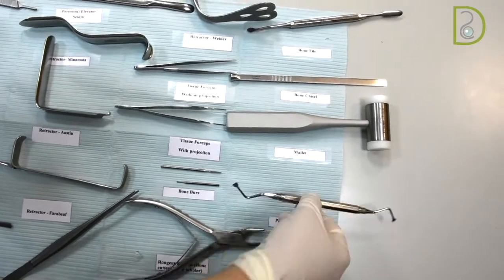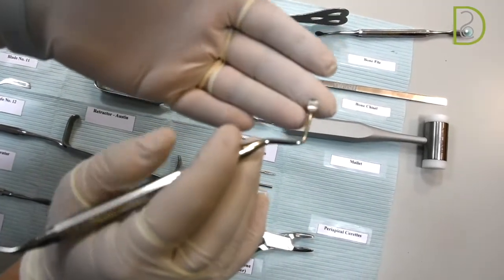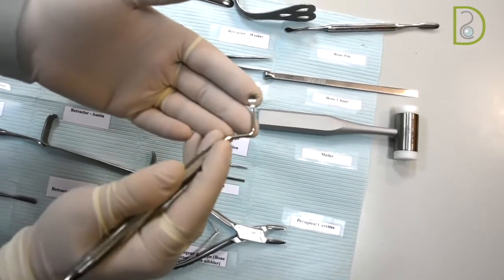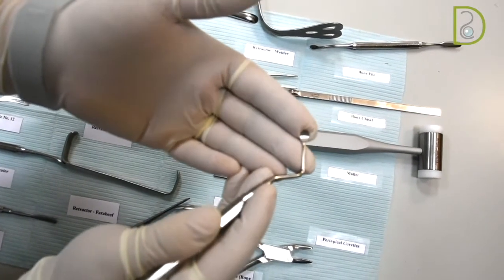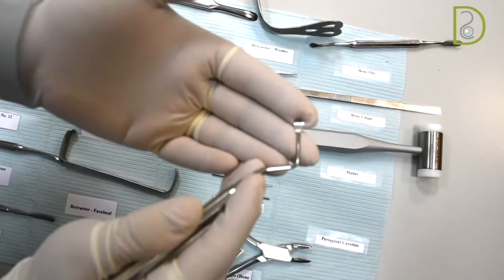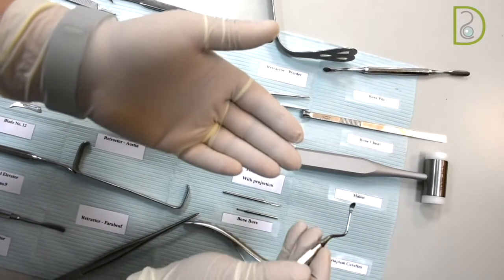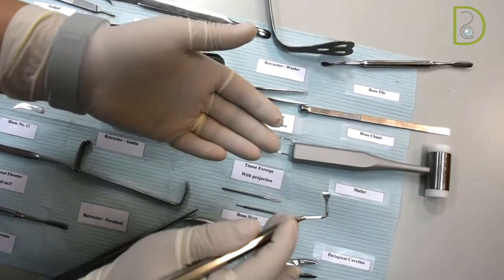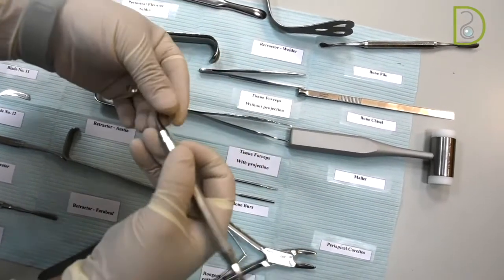Coming to the periapical curette. The periapical curette will go into the socket. Let's say, for example, you have a pathological disorder that you have seen in your x-ray, like a periapical cyst or periapical granuloma. Over here, you have to take out that infected tissue or it will affect your healing process. So to get rid of it, you will go inside the socket and you will scoop it out. Or for example, if you have any debris that has fallen into your socket, also you will clean it and make sure that it's clean using the curette.